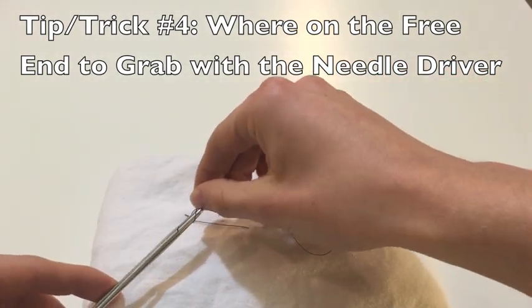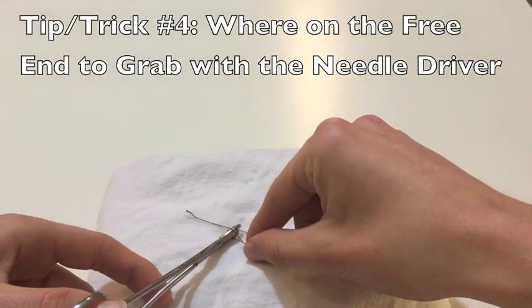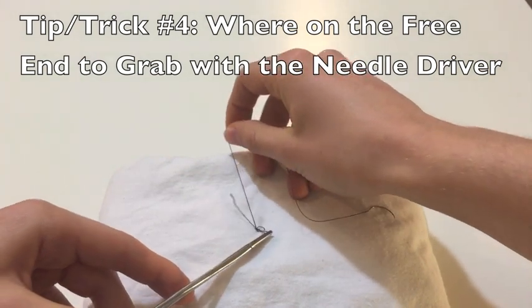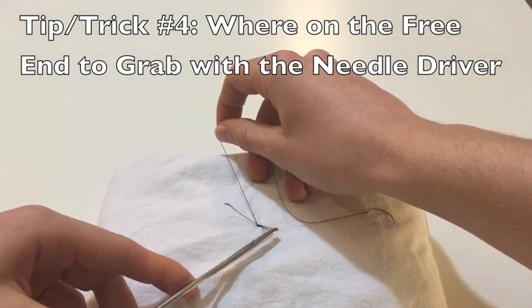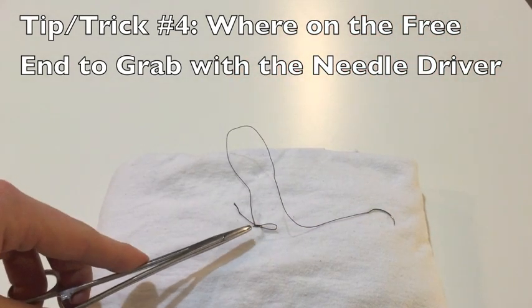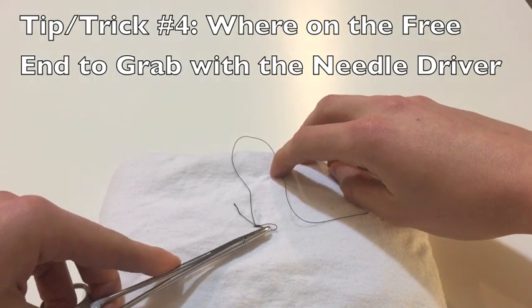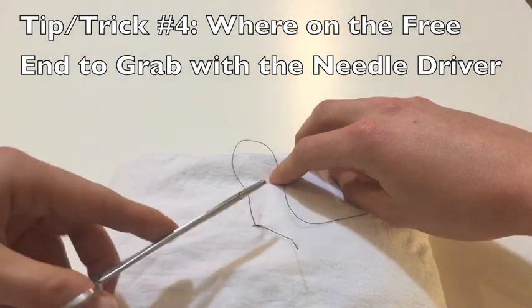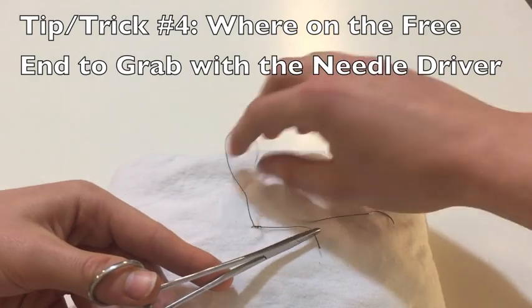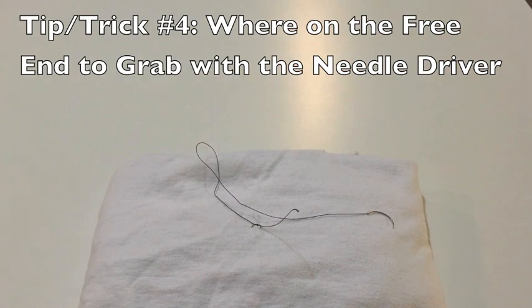So I come around, wrapping that surgeon's knot, but instead I'm going to grab down at the base. When I pull through, you can see that instead of having that nice knot that laid flat, I end up with a loop. To eliminate that loop, you end up needing to use an instrument to pull the free end through — something you can avoid by grabbing at the end of the free end. That's my fourth tip: where on the free end to grab with your needle driver.